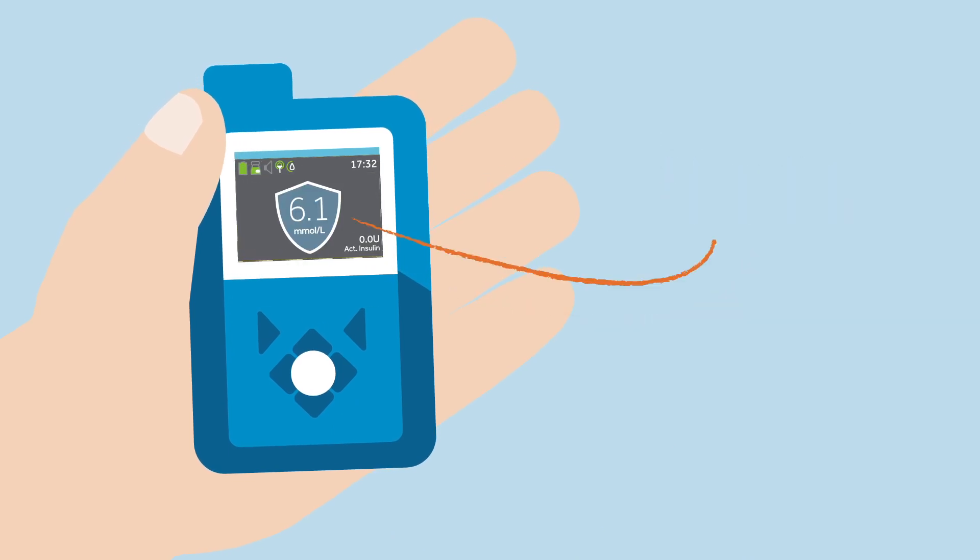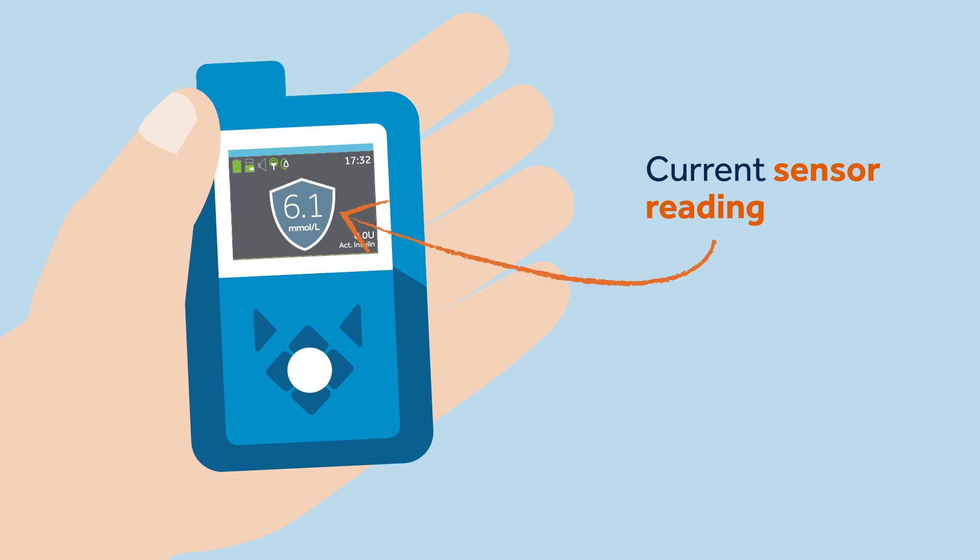After delivering the bolus, the pump returns back to the home screen, which shows the auto mode blue shield with the current sensor reading.